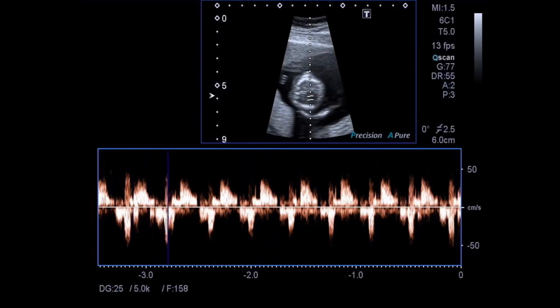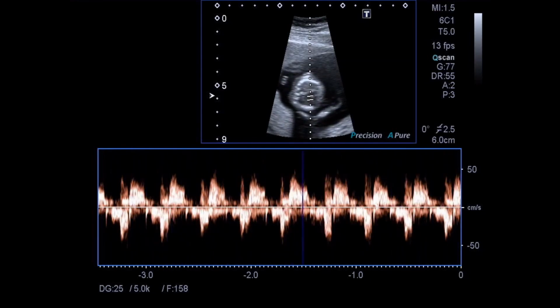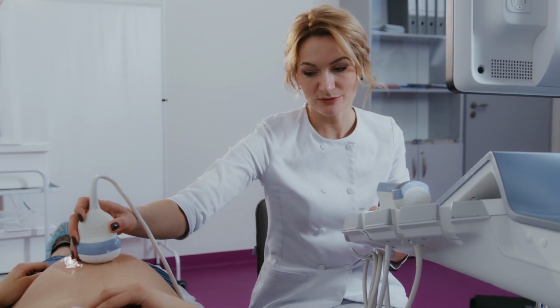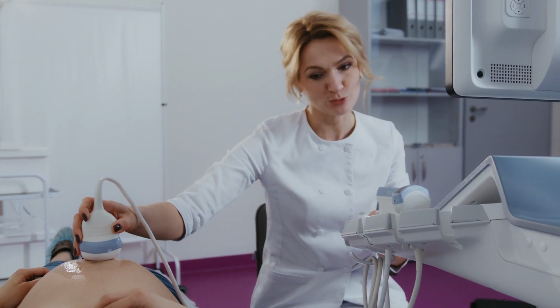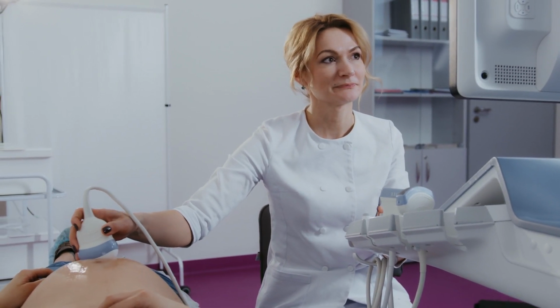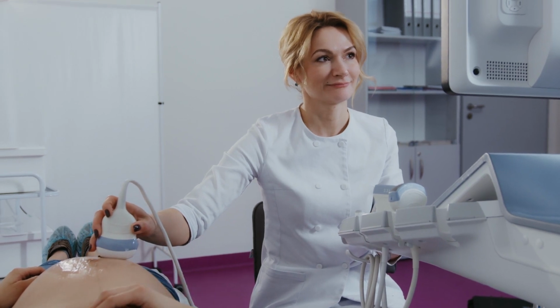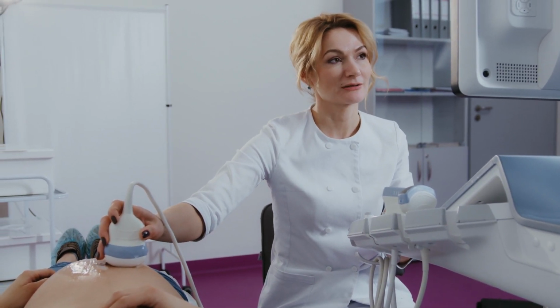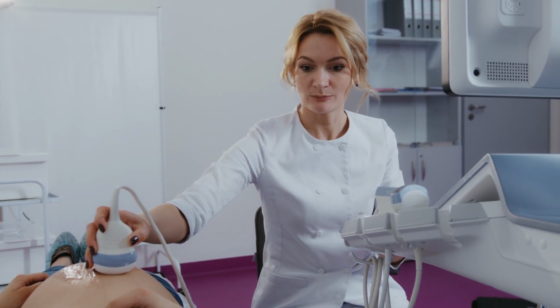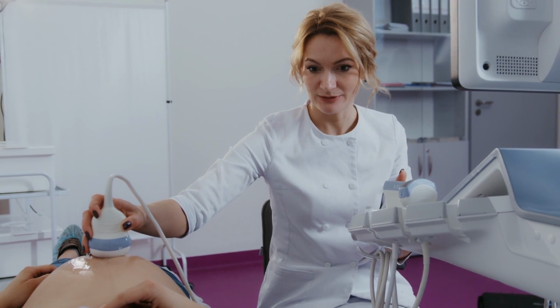By following these steps and understanding the specific characteristics of each body part, you can effectively interpret ultrasound images and provide accurate diagnostic information. We definitely need to place the probe on the patient, otherwise we won't get an image, which would be silly, wouldn't it? So first, you'll want to apply a small amount of ultrasound gel to the patient's skin, over the area you're interested in. This gel helps the sound waves travel efficiently by ensuring good contact between the probe and the skin.